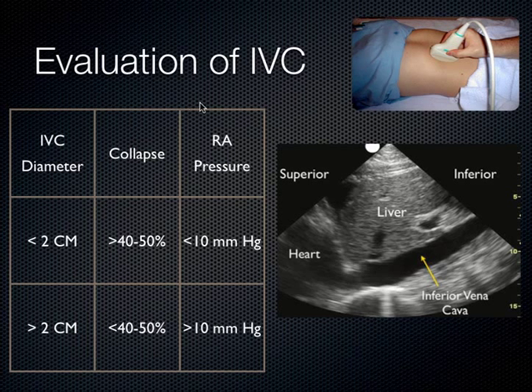So first off the bat, where do you stick the probe? You put it right here along the parasagittal to the right in the sagittal view. So we have the indicator of the patient's head in a sagittal view, and I say right parasagittal. What does that mean? Sagittal means right down the center of the body.